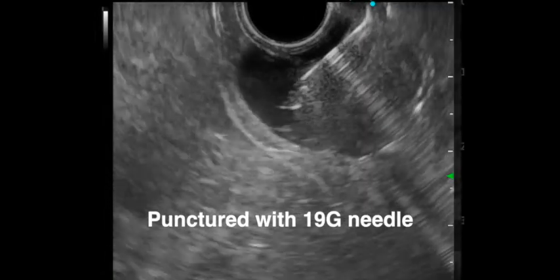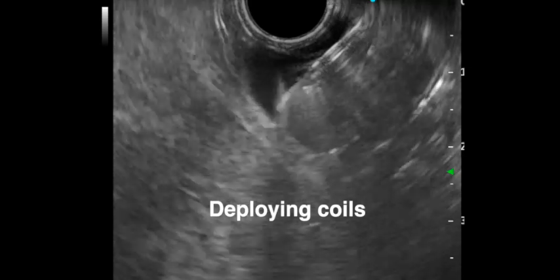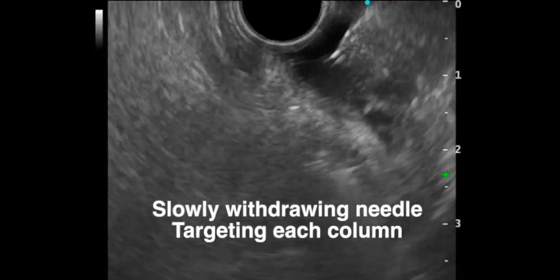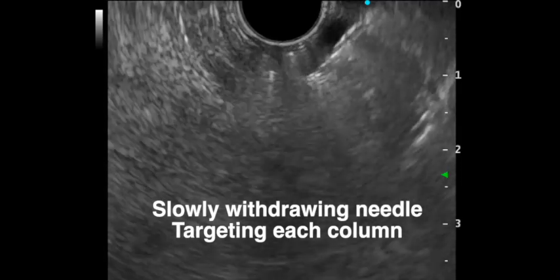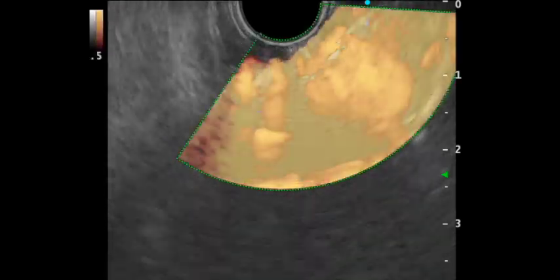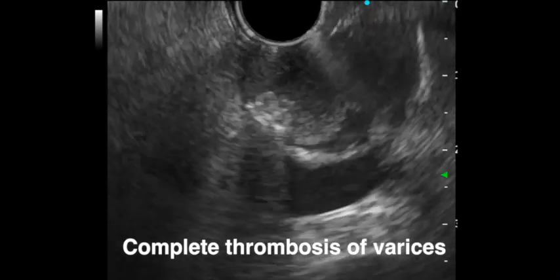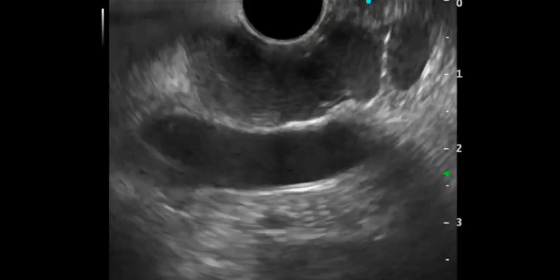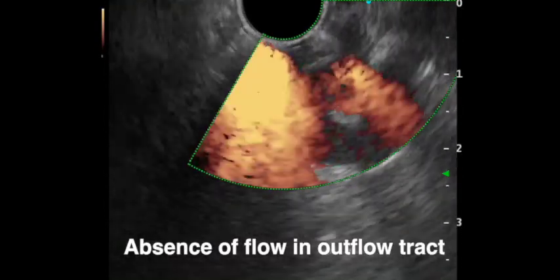Under EUS guidance, the varix was punctured with a 19 gauge needle and coils were deployed. One coil was deployed, and after deploying that coil, the needle was withdrawn gradually and another two coils were deployed. Post coiling, 1 cc glue was injected. Following that, complete thrombosis of the varix with a glue complex was seen within the varix, and thrombosis of the outflow tract was also noticed on EUS.